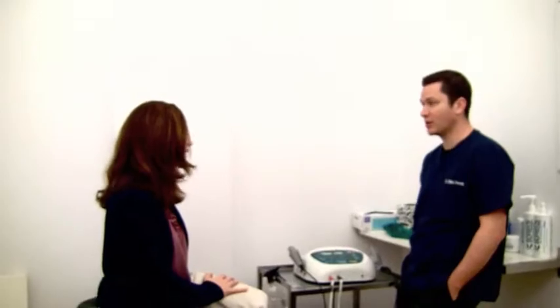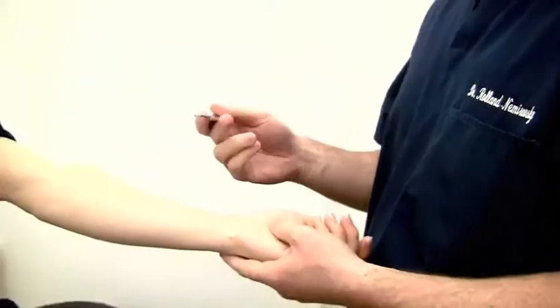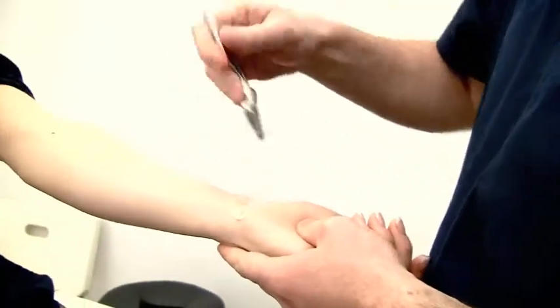Kinesio tape is great in that it helps with function, restoration of normal activity within the tissues themselves, lymphatic drainage, which is great combination therapy for any type of tissue malfunction. Electric stim helps with conditioning the muscle. Typically what you want to do is get the muscle to fatigue. Fatiguing the muscle, it relaxes, and therefore you're going to release some of the stressors, specifically if the muscle is in spasm. So here I'm using Graston Tool 6.